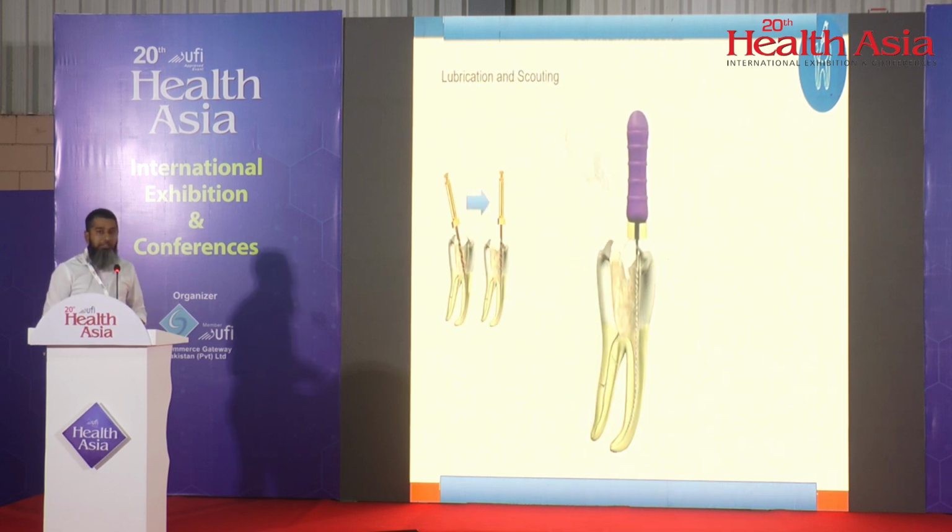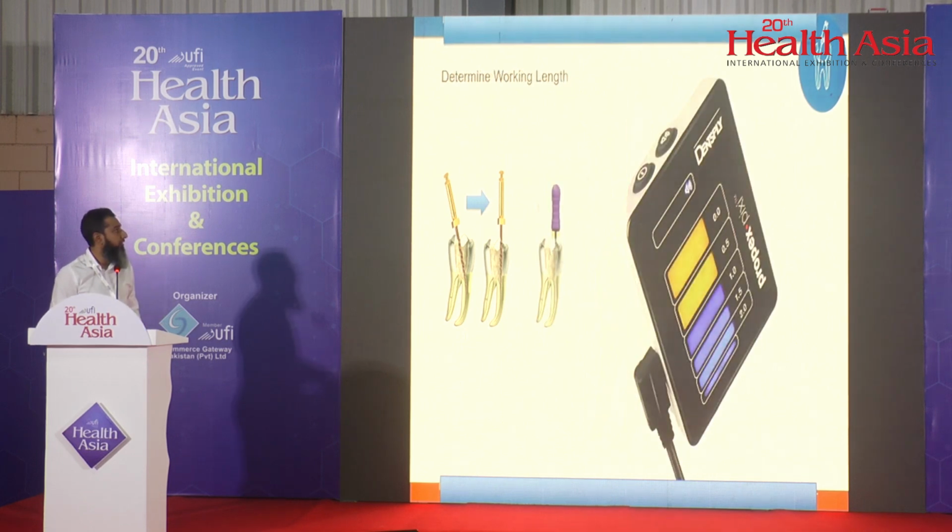Okay. Then comes negotiating a canal. We all know when you're negotiating a canal, we use this patency file or number 10 K file, which is used to negotiate canals. So with this, with our watch winding action, we slowly try to negotiate the canal, and this way we need to reach the working length of the canal. And then we can move on to our rotary instruments.